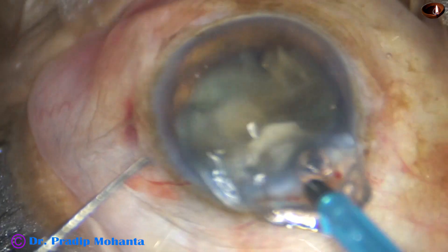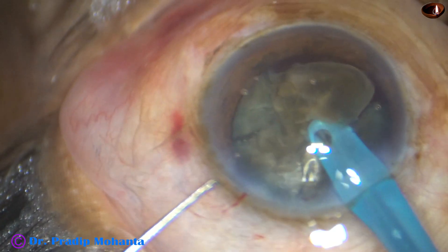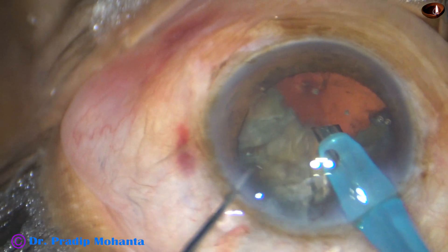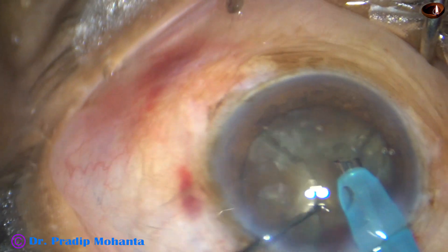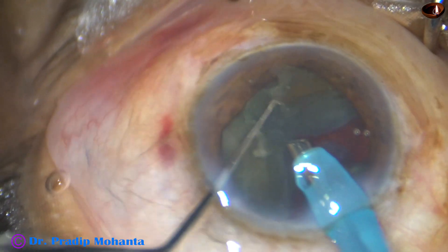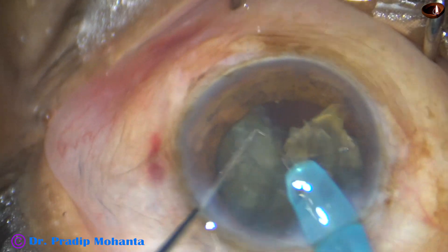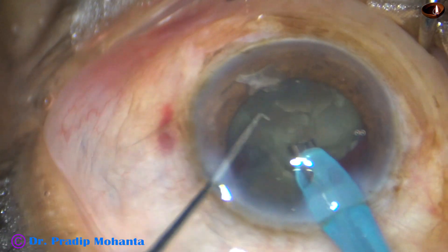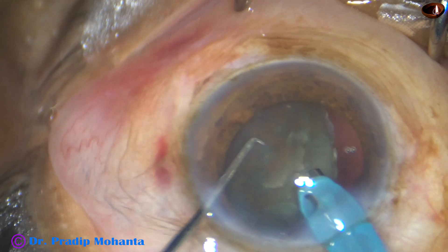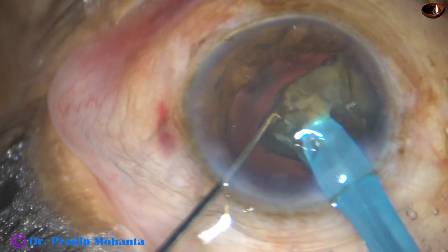The phaco needle is introduced again and the free nuclear fragment is emulsified, bringing the fragment right to the center of the anterior chamber at the iris plane. If we emulsify the pieces at the iris plane, the corneal endothelium is nicely protected. Now see how I am separating the fragments — I tilted, and where it was attached, I applied some ultrasonic energy and the fragments became free. If we can emulsify one fragment, the others can be made free by just tilting and applying a little ultrasonic energy at the band joining the fragments.